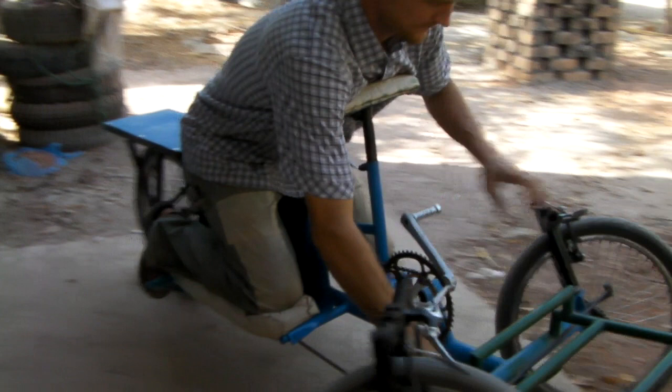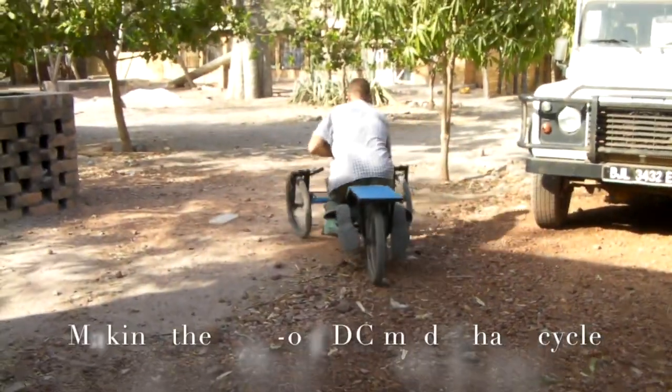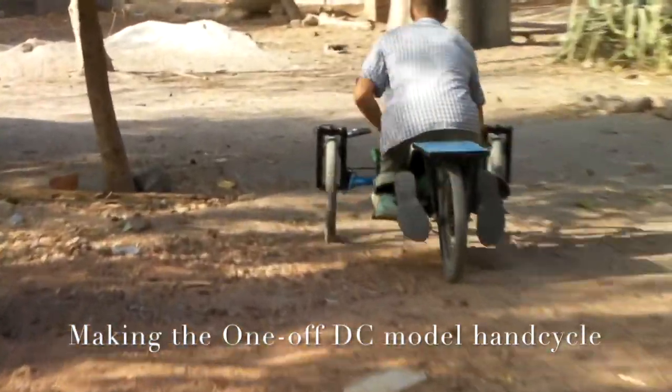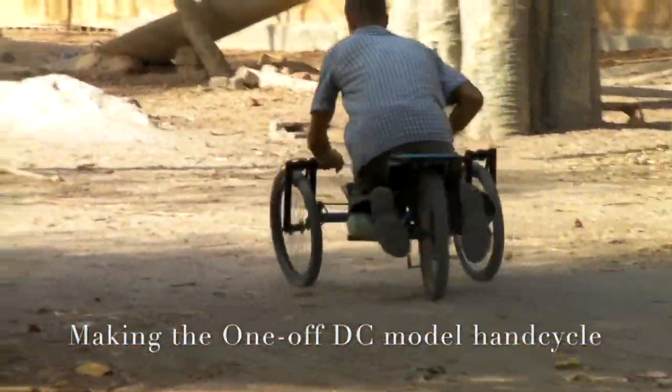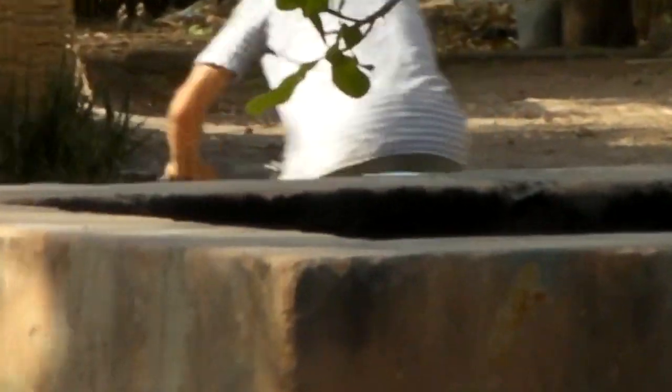Wait a second — who is this guy, why is he on a hand cycle, and when is this anyways? Let me take you on a little journey of making the one-off DC model, way back when, years ago.